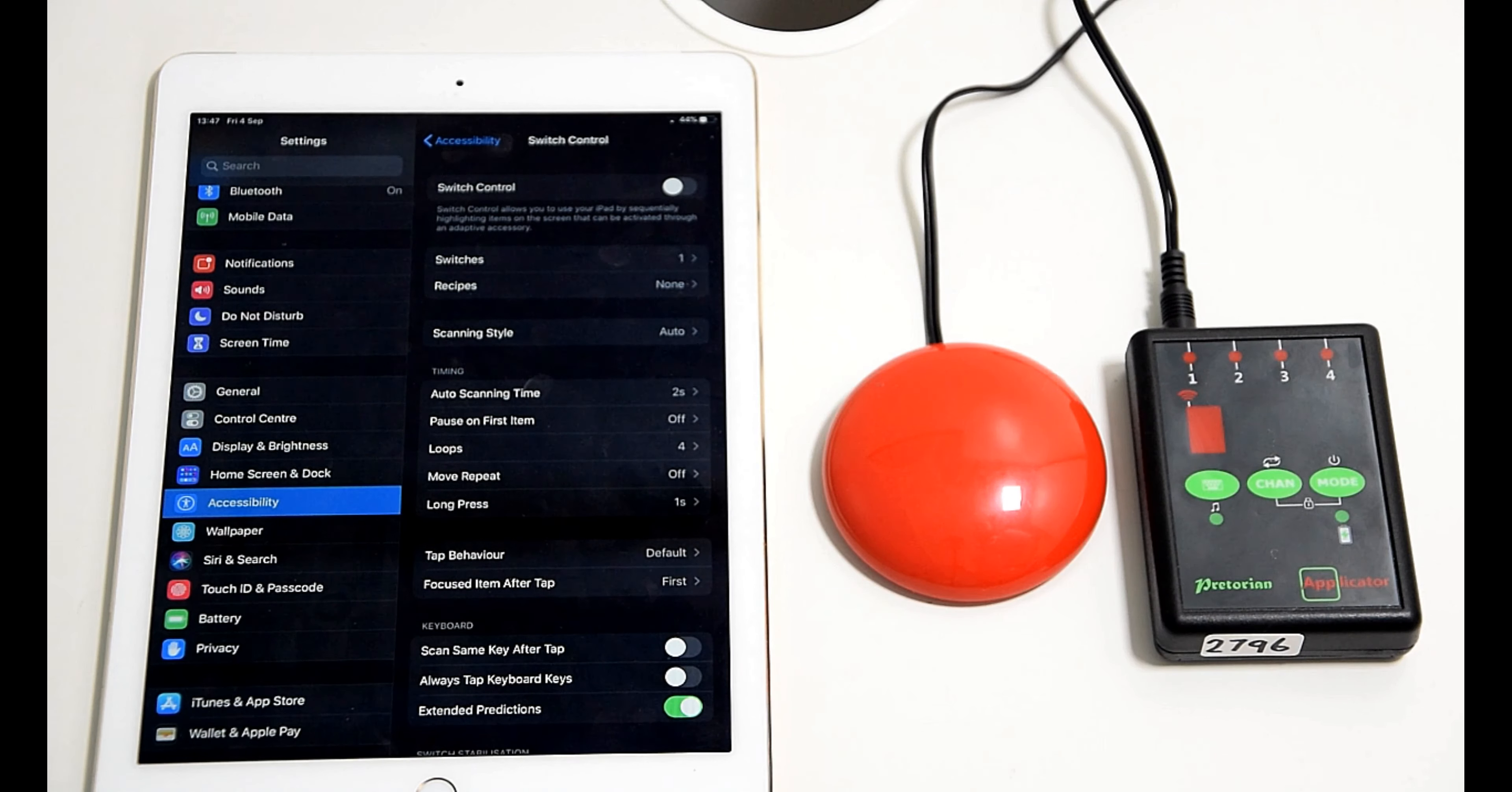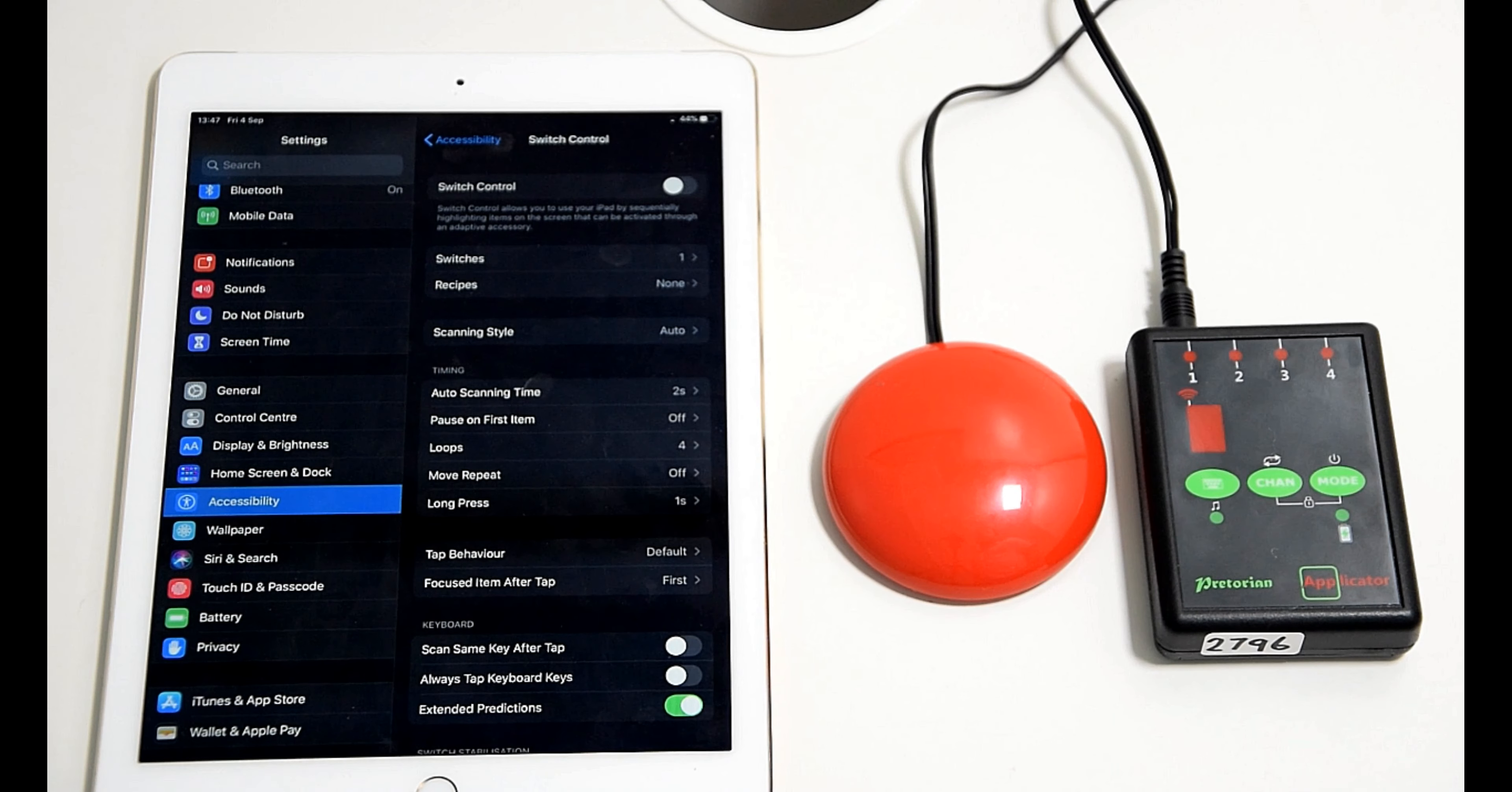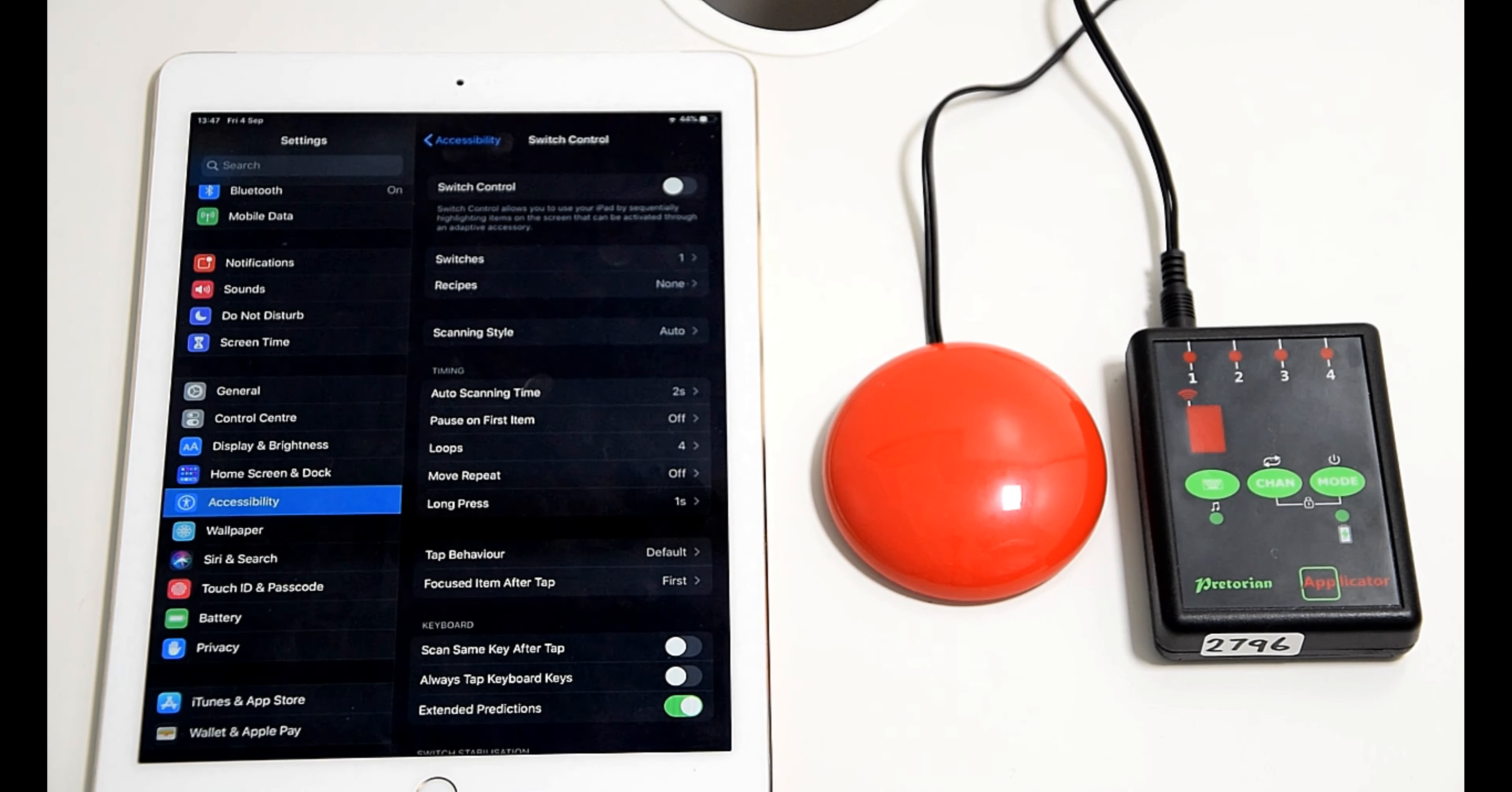It also gives you a couple of other options. For example, loops set to four means it'll go through every single app option four times before it stops.